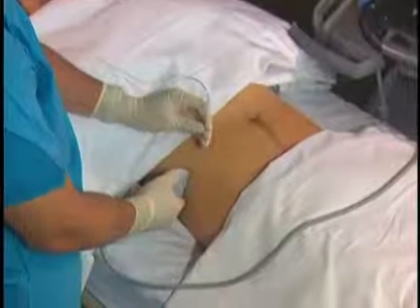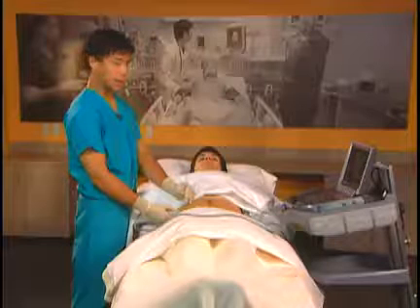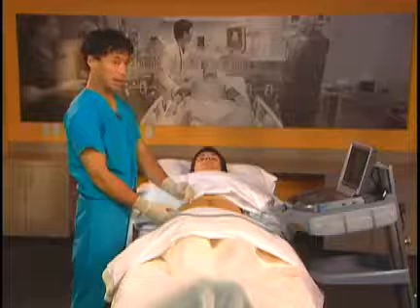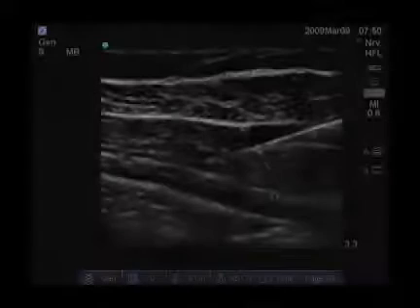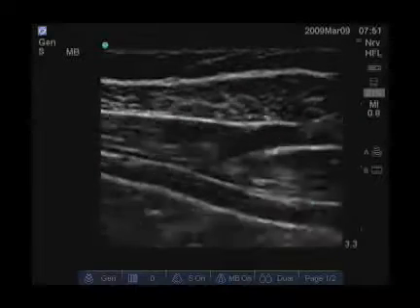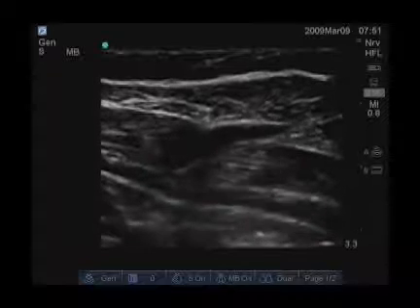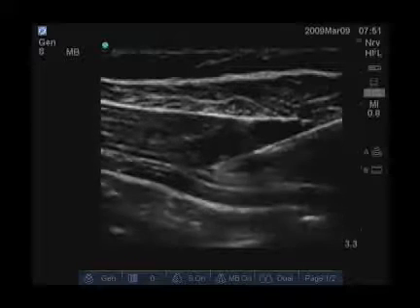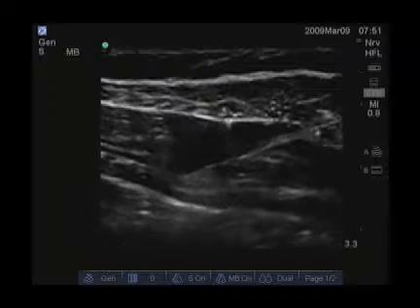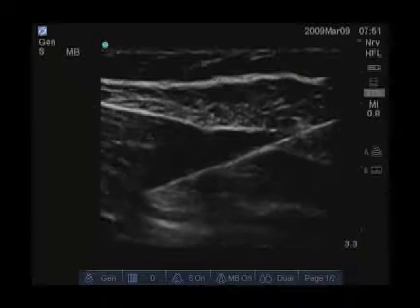I like to advance my needle in a shallow plane to view it first, and then advance it a little bit deeper. I'm going to deposit local anesthetic — between 10 and 20 milliliters — between the two deepest muscle layers, the internal oblique and the transversus abdominis. In this image, we can see the three layers of the abdominal wall: the external oblique, internal oblique, and transversus abdominis. Below the transversus abdominis is bowel, and you can see that moving, so we want to be very careful not to advance our needle too deep. Our goal is to inject between the internal oblique and the transversus abdominis, so we carefully position the needle tip there and inject our local anesthetic.